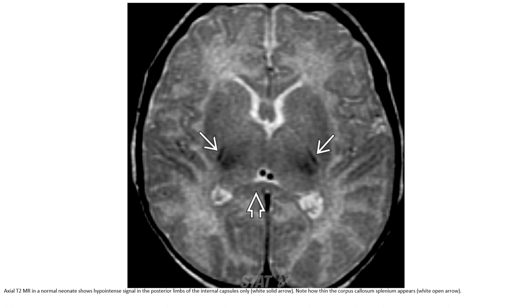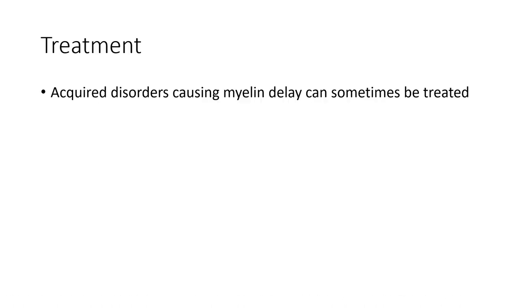T2 in the normal neonate shows hypointense signal in the posterior limb of the internal capsule only. Note how thin the corpus callosum splenium appears. Disorders causing delayed myelination can sometimes be treated.